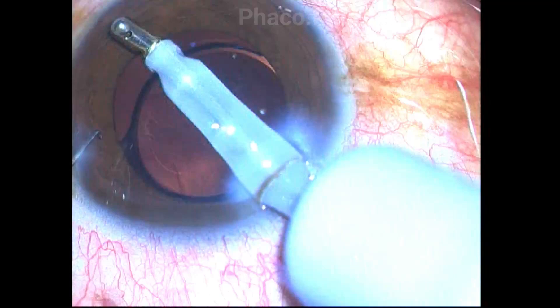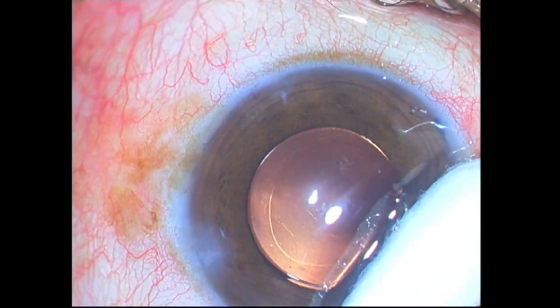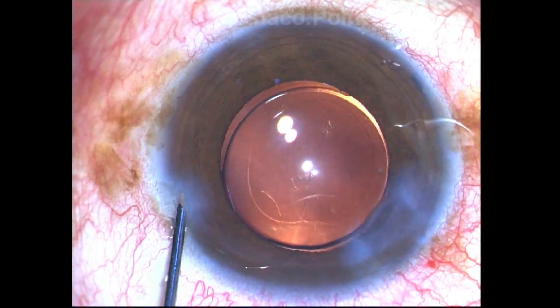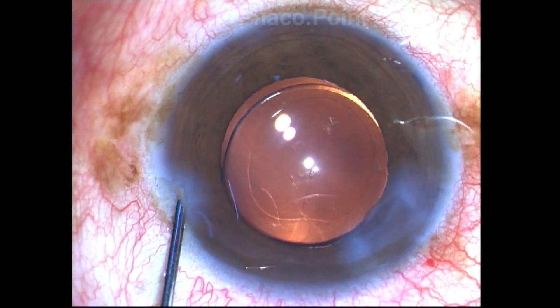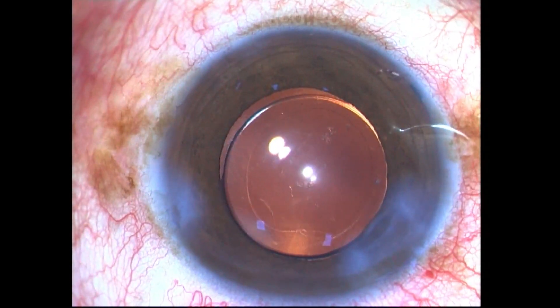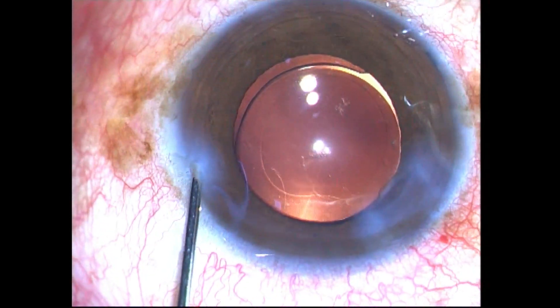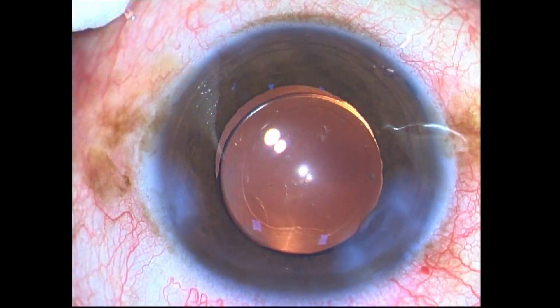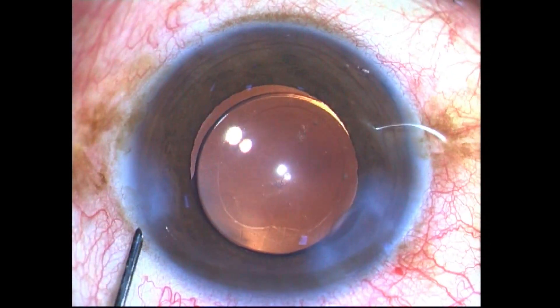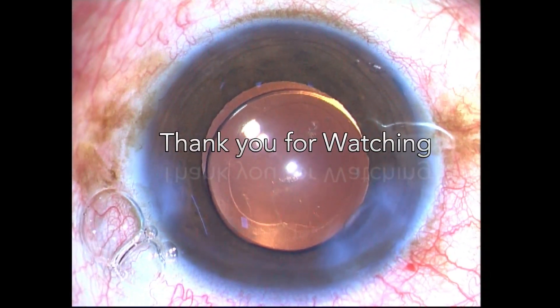The IOL helps to maintain compartmentalization between the posterior and anterior segments of the eye. Without it there may be increased endophthalmodonesis, which can increase the risk of cystoid macular edema and retinal detachment postoperatively. The IOL is well centered; I inject fluid cautiously at the side port, hydrate the main incision, and close the case with intracameral moxifloxacin suitably diluted.